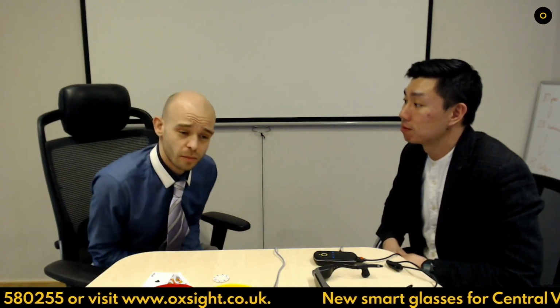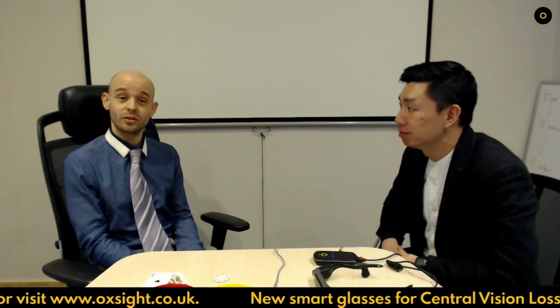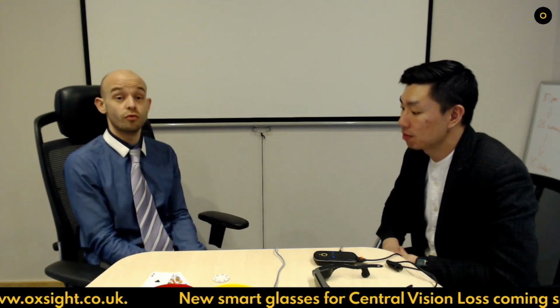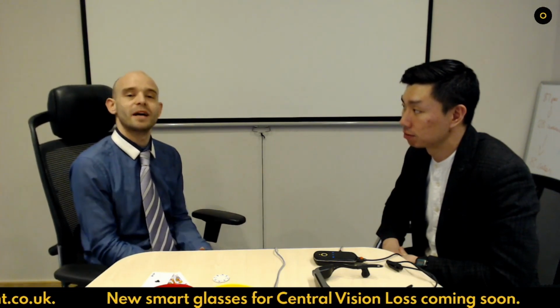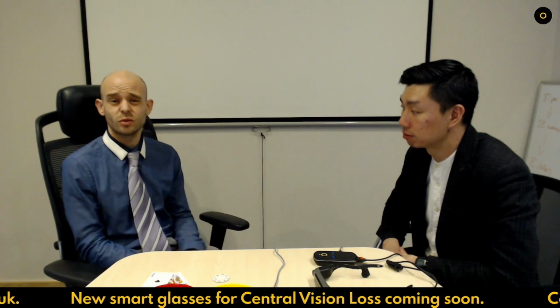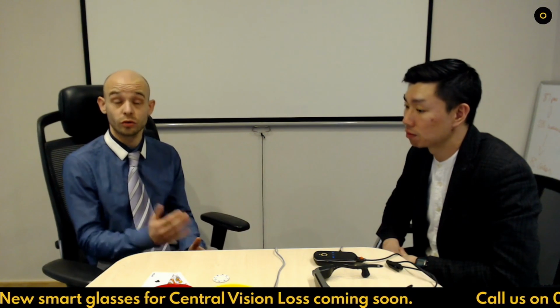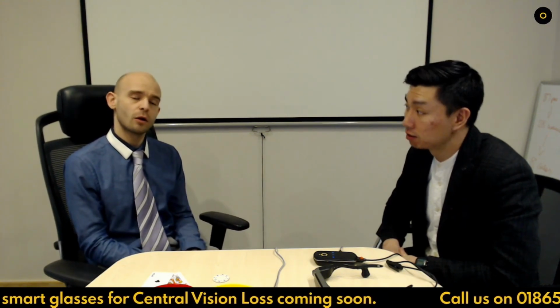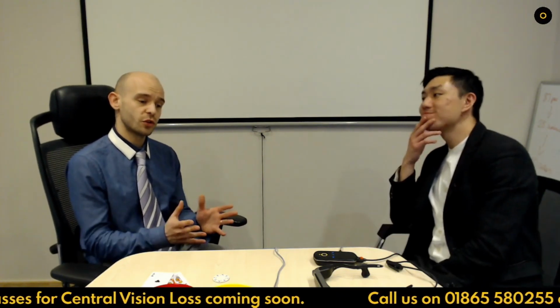Yeah, excellent. So what we'd normally see in a demonstration is, first off, we would like to get to know a little bit about you, and about what you would be expecting to get from the glasses. If you could achieve something, is there one particular thing you really would like to achieve? Then we would do some of the medical things, nothing too strenuous, just checking a bit of your clarity, checking what you can see without the glasses and with your prescription glasses, and then trying the glasses on. We'll skip past that first part and go straight to trying the glasses on.